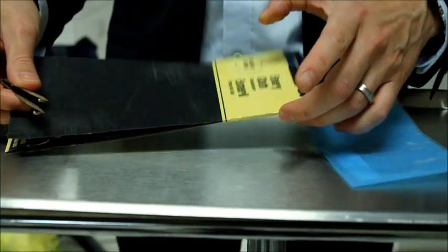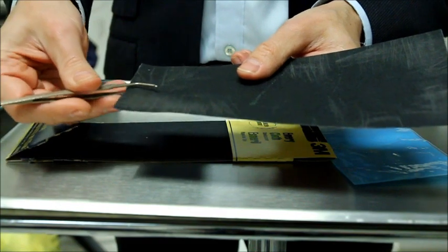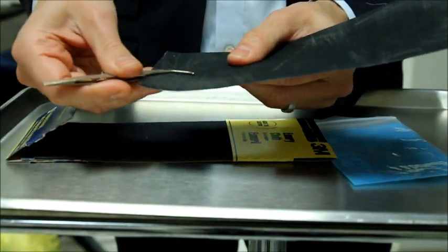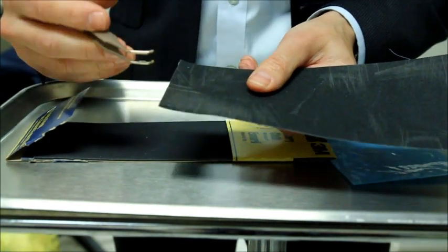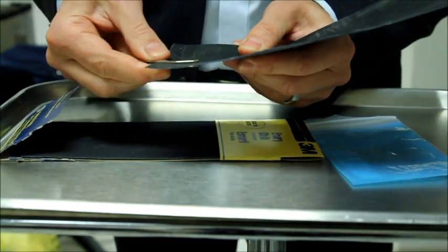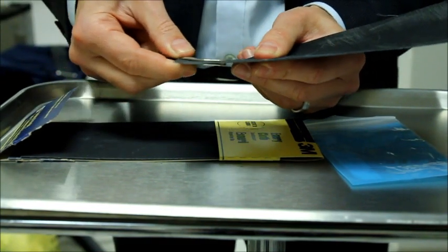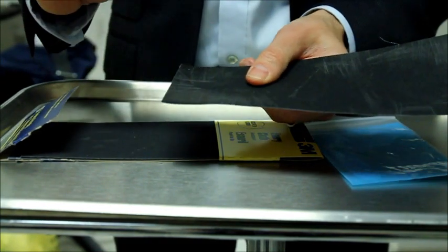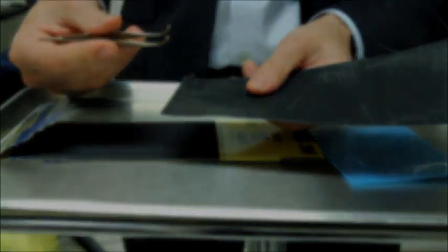So we're taking an emery cloth that you can pick up at a hardware store using the fine grade, and we place it in between the forceps and make some passes like this. That's going to smooth out some of the pitting that's on the surface of the platforms that occurs during the printing process in stainless steel. So that's now smoothed out the platform and now we'll be able to transfer the ink more easily.